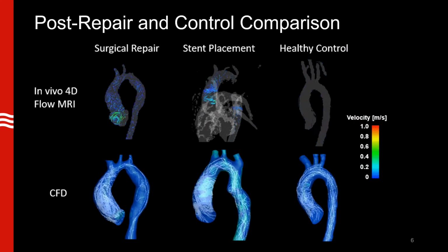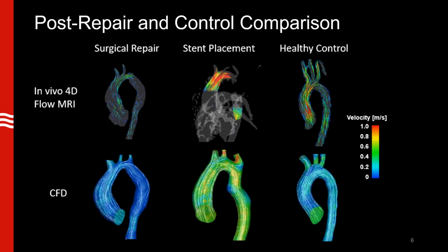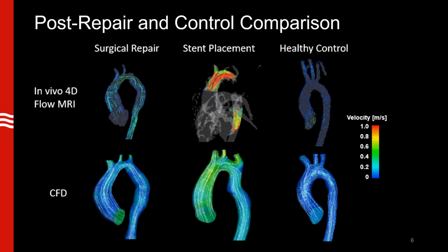And finally, we compare the post-repair cases to the healthy control. We can observe that the healthy subject has more laminar, less complex hemodynamics.